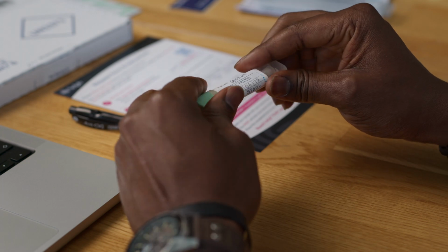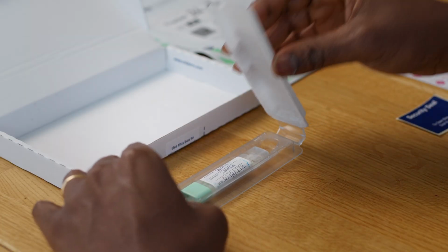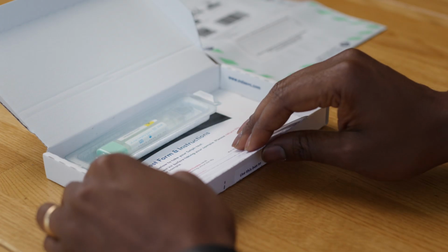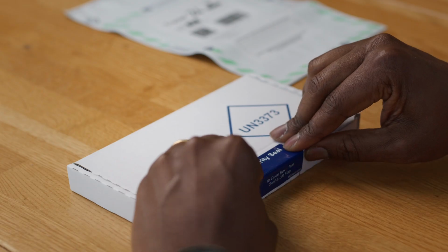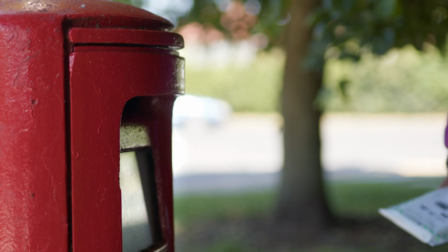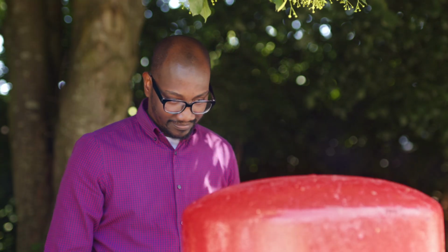After you've cleaned up, double check that you've stuck the sample label onto your collection tube. Seal the tube in its protective cover and put it in your kit box along with your request form. It's really important that you include this request form, otherwise the lab won't know what tests to run. Put everything inside the return envelope and drop it into your nearest post box as soon as you can. It's best to make sure to post before the last collection on Monday to Thursday.